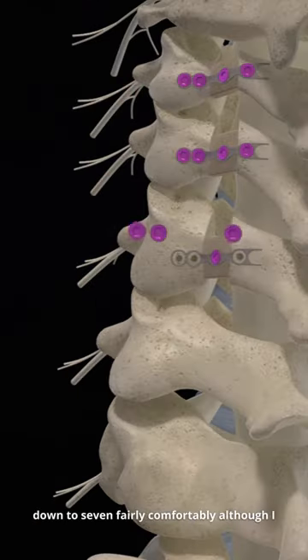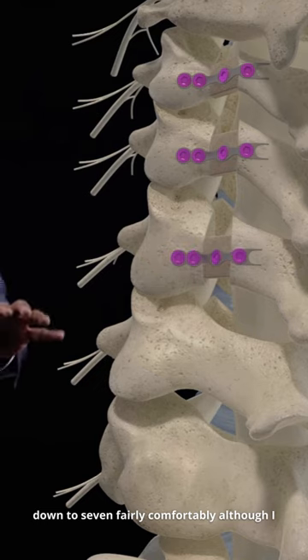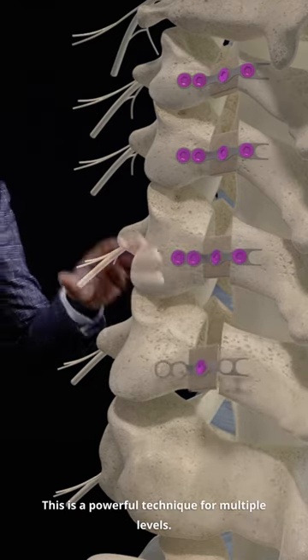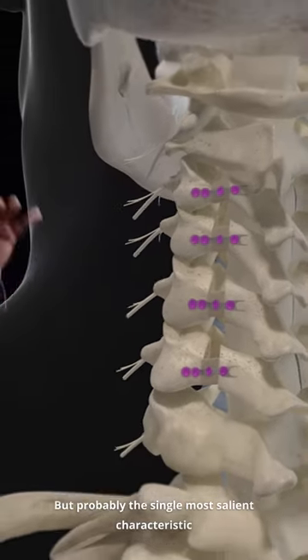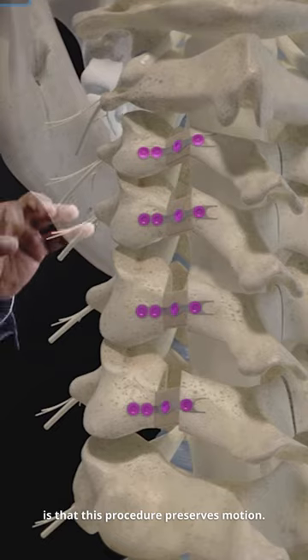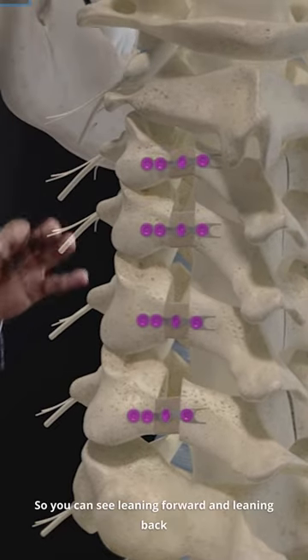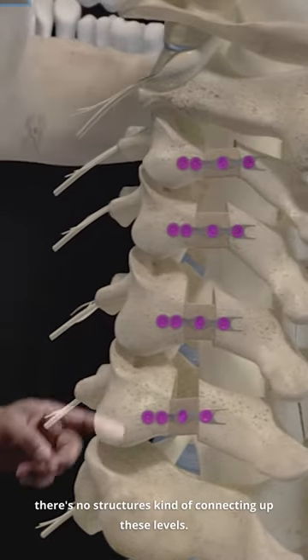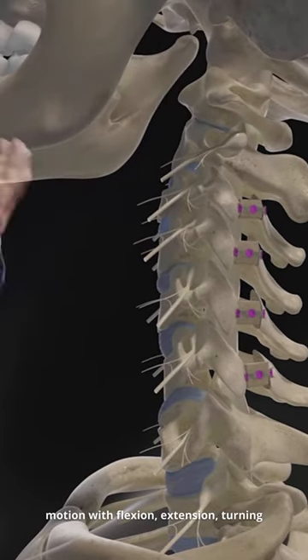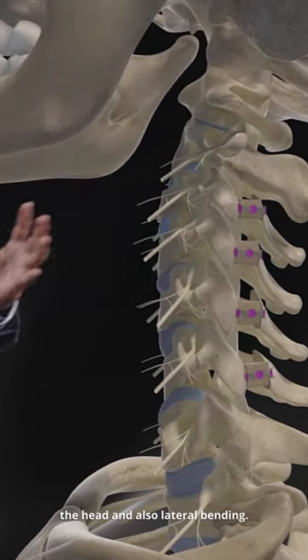You can really do anything from C3 down to C7 fairly comfortably, although I tend to do C3 to C6 primarily. This is a powerful technique for multiple levels. Probably the single most salient characteristic is that this procedure preserves motion. You can see leaning forward and leaning back — there are no structures connecting up these levels — and this preserves motion with flexion-extension, turning the head, and also lateral bending.